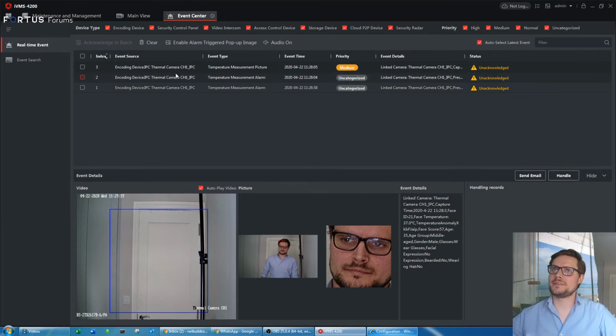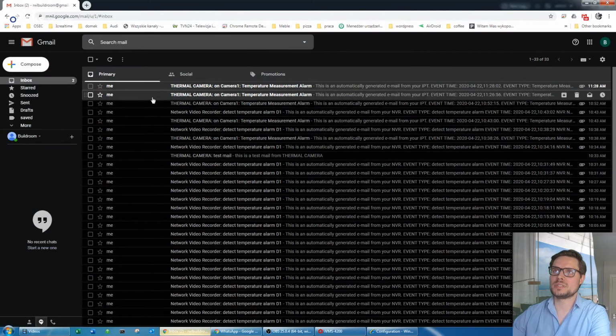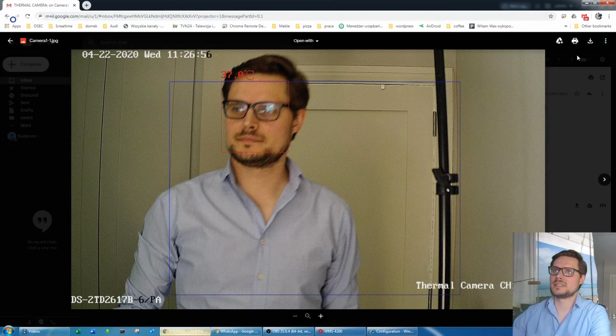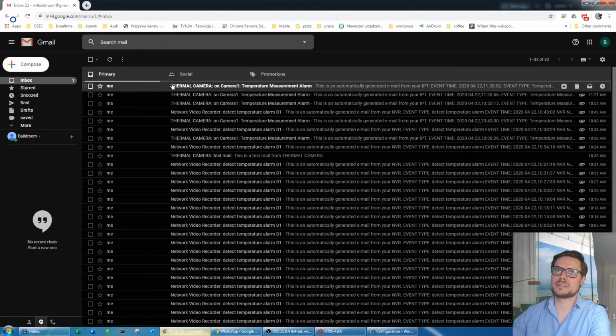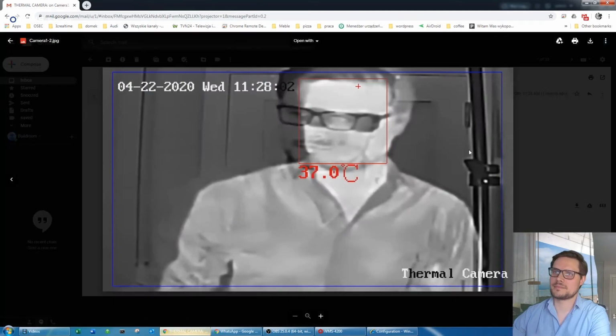So these are the current events, the most recent events that have been triggered. Of course, you can manually send an email or you can handle it. For example, you can just click handle and type in test and just click OK, and that has been acknowledged. But also I should receive an email with the notification. This is an example of an email. The temperature has been triggered, two snapshots sent from the camera.